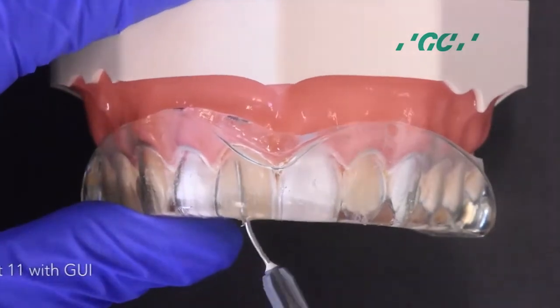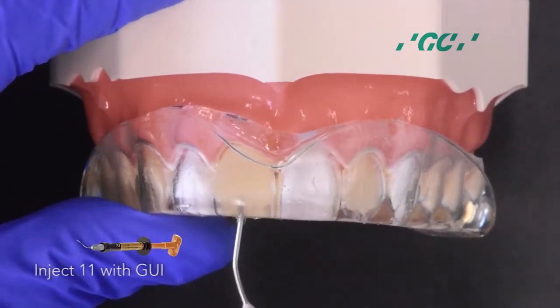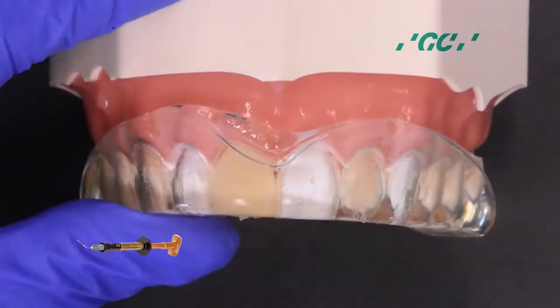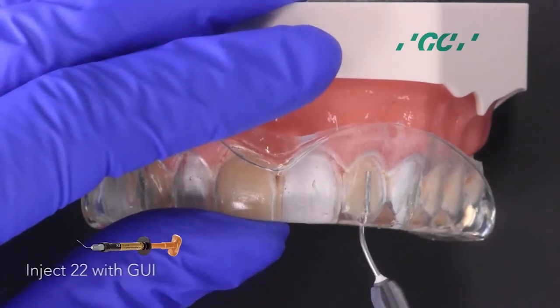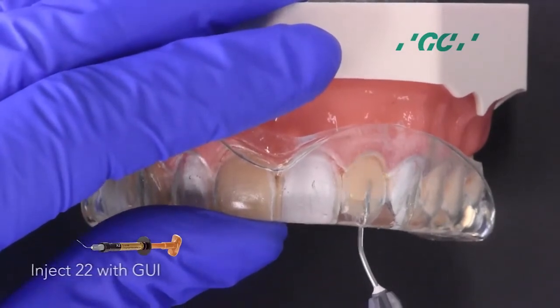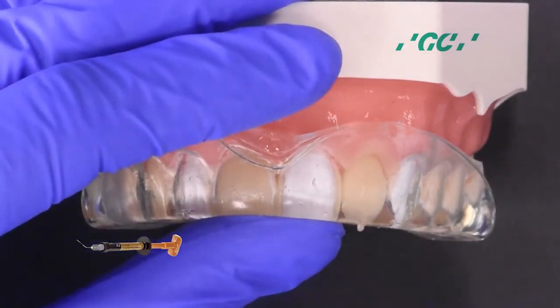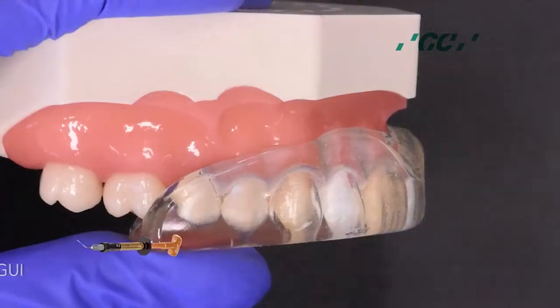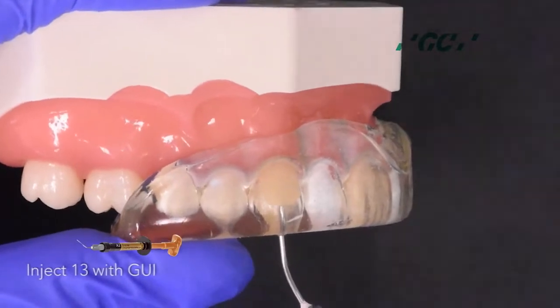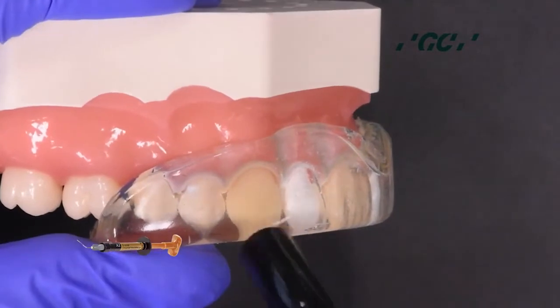Start injection moulding on 1-1 with Genial Universal injectable, then light cure through the clear stent. Inject 2-2 with Genial injectable, then light cure.